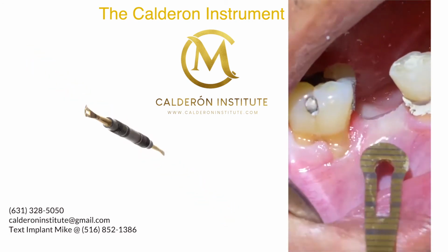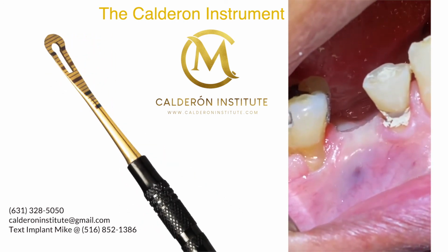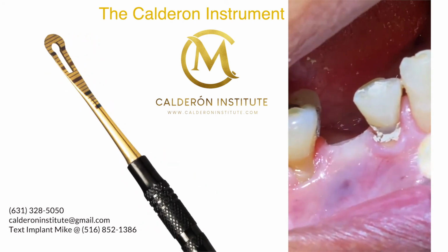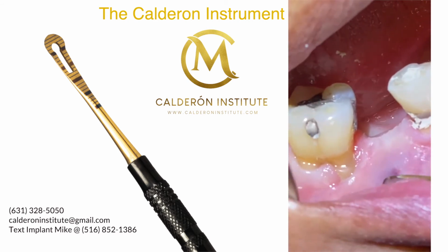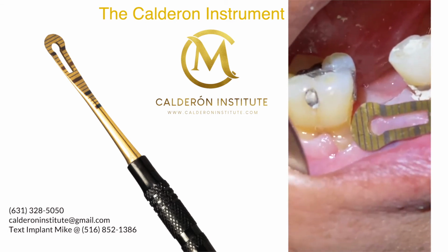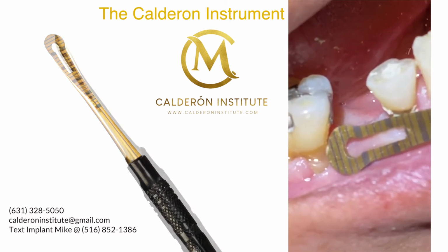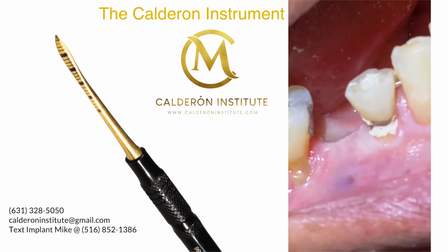Now some people say, yeah, but that's soft tissue, all that. There's always an SA involved in the lectures, and those of you who have been with Calderón Institute and Implant Mike, you know what an SA is, the letter S and letter A. Okay, so here you go again. It's about 9 to 10 millimeters. Okay, so we're going to place one implant.